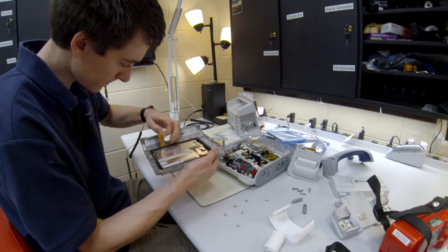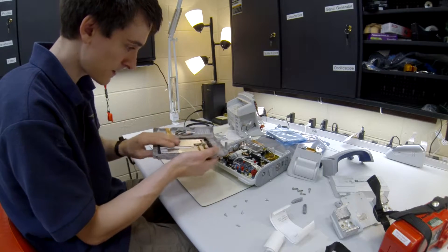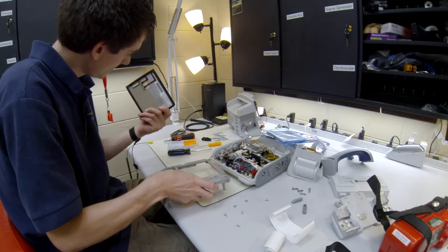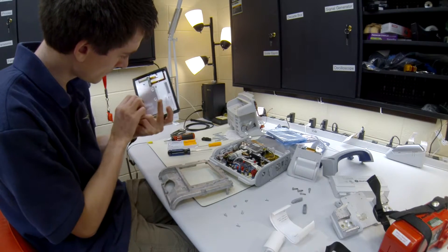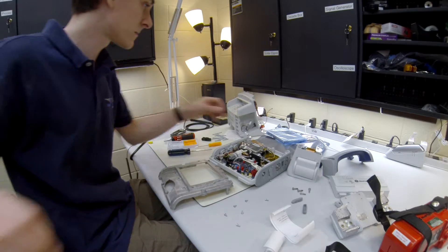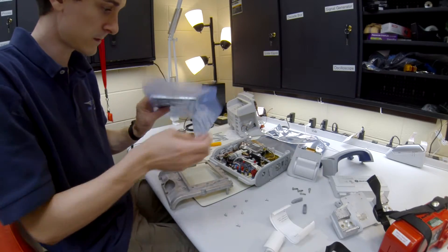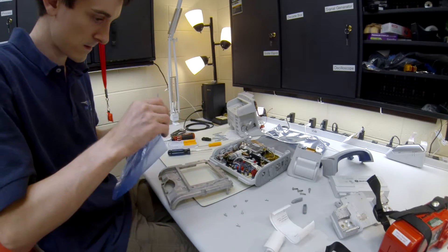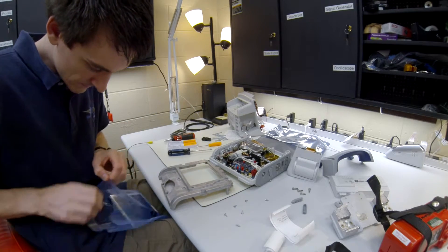We are going to pull this piece off. Pop out the LCD — nothing on there that we need to save. So here is our new LCD screen. Actually, we need to save that black piece.